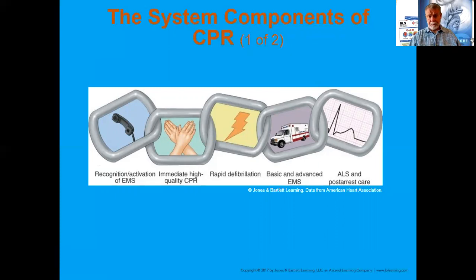Rapid defibrillation. So again, the sooner the AED gets there, the better off your patient is. When you look at some of the studies and the numbers, an AED that's placed on the patient within the first 2 minutes can have upwards of a 50% survival rate. That's pretty good, but that's why AEDs are also in grocery stores, in gyms, right? You go to the movie theater or casino, you could see an AED there. If it's not just the employees that are around, you can grab that off the wall and put the pads on the patient and determine if they need a shock.